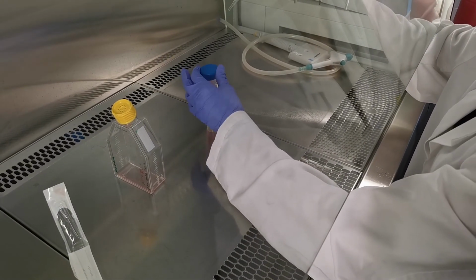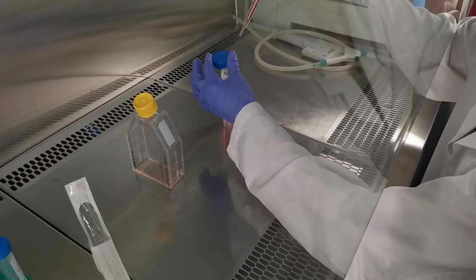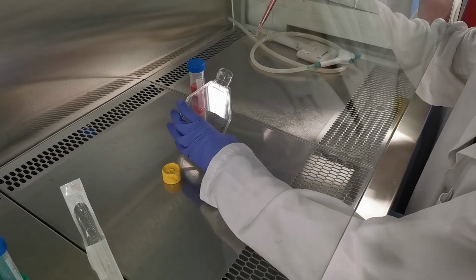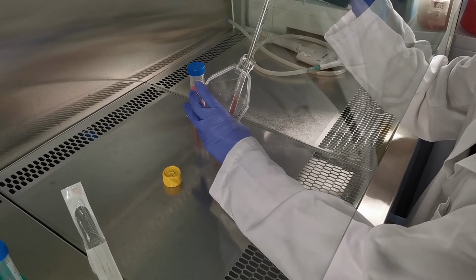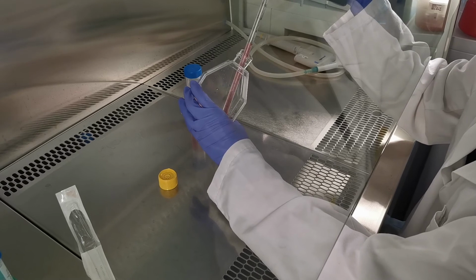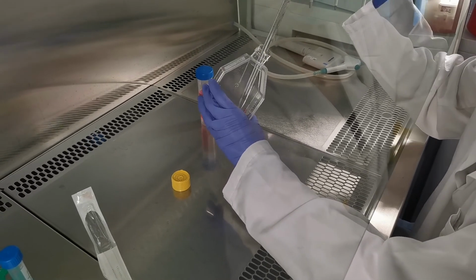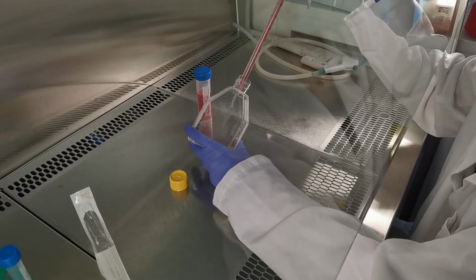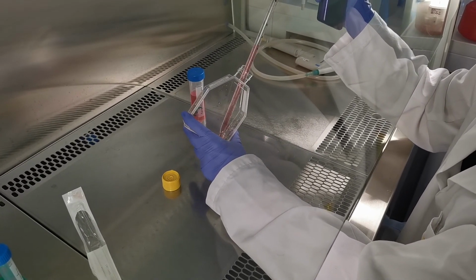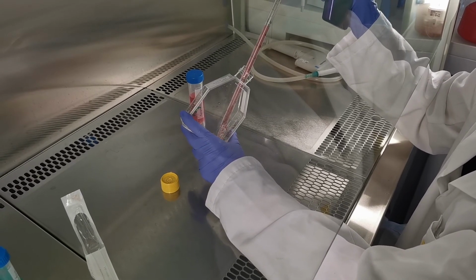Aggregation medium is added to the flask and the cells are mixed. The amount of medium added is dependent on the density of the cells within the flask. For example, stellate cells are quite large and are not generally dense in the flask, therefore require only a total of 5 ml before counting. Whereas HepaRG are smaller and there are many more cells in the flask, meaning that counting using 5 ml would be very difficult, so we resuspend in larger amounts of liquid to have a final volume of 10 ml.